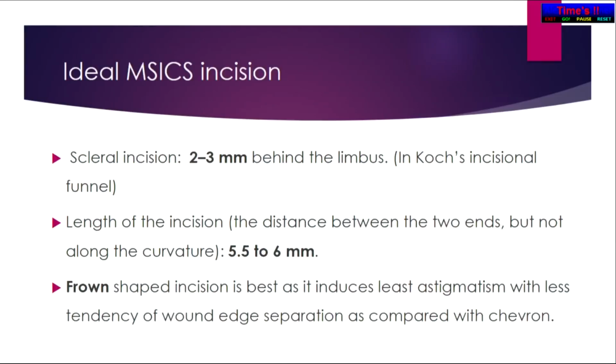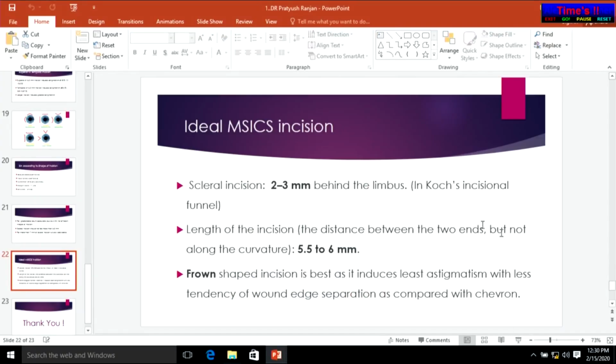The problem with the conjunctiva is that you lift the conjunctiva first. No, he is not excising the conjunctiva. He is simply obviating one of the steps. So the conjunctiva is going to be there to cover your wound, so don't get worried. At the end, I'm quartering it. I just want to show that video, please. The only thing is, it's a little difficult to sometimes dissect with the conjunctiva on.